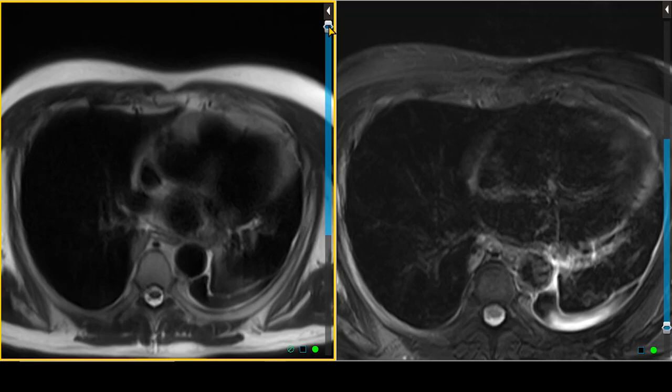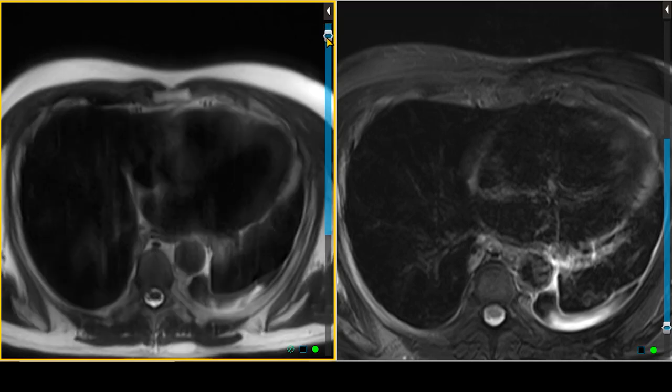This next case is a 66-year-old male who had an indeterminate mass seen on CT imaging and also has a history of lung cancer. They wanted to get an MRI to figure out whether this mass was a metastasis or something they don't need to worry about. We'll start looking at our MR images, starting off with our T2-weighted images.